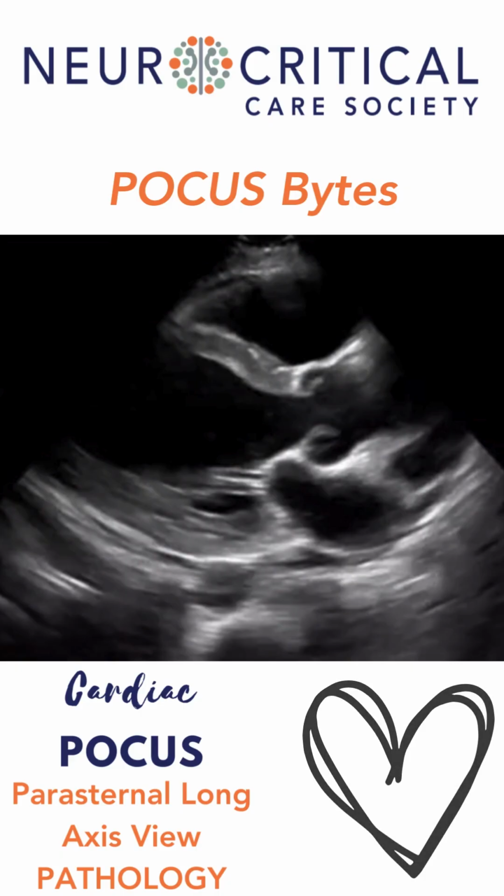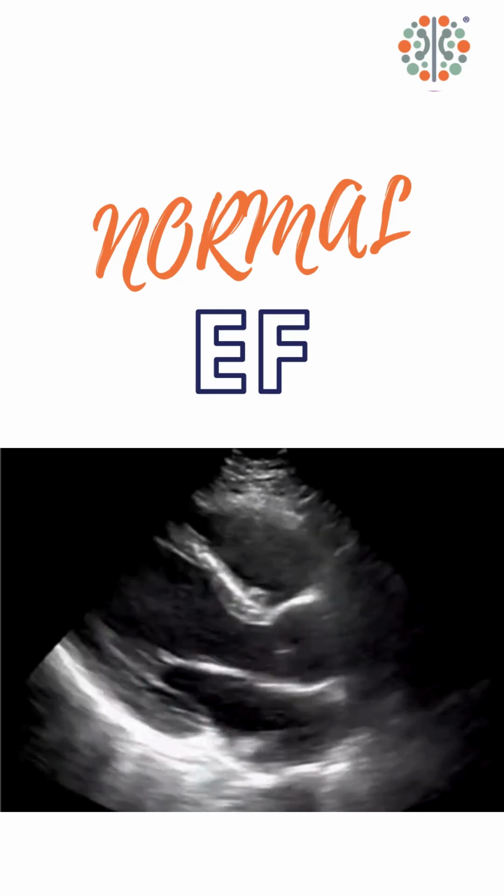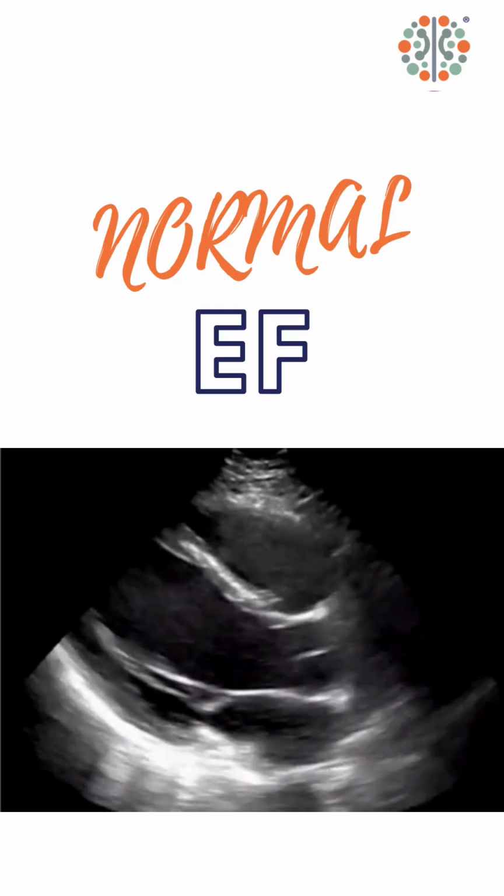On behalf of the ultrasound section of NCS, welcome to a bite-sized tutorial on cardiac POCUS, where we will focus on examples of the parasternal long axis view pathology to follow up on our previous video on the parasternal long axis view. My name is Diana Alsbrook, a current Neurocritical Care Fellow and ultrasound enthusiast, and I'm excited to learn with you again today.